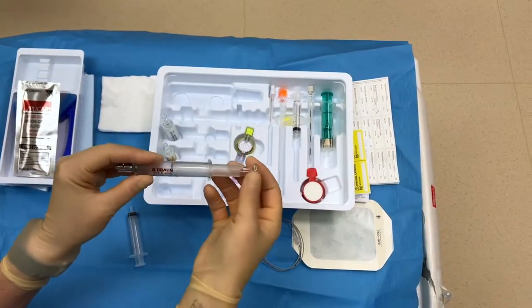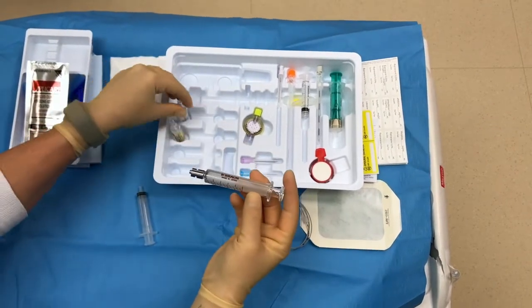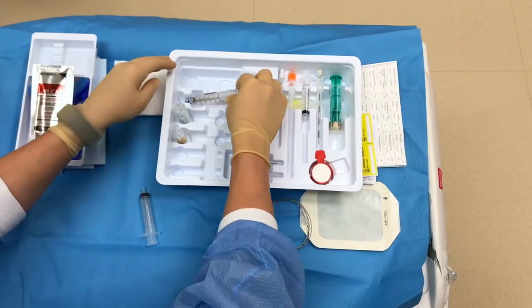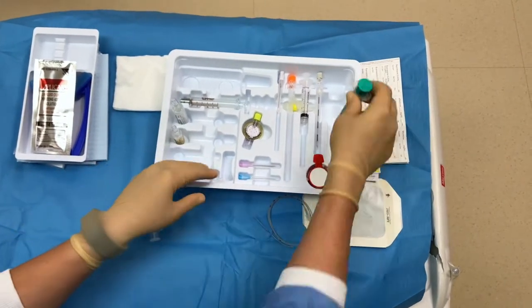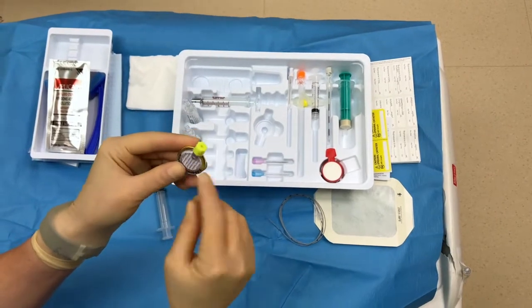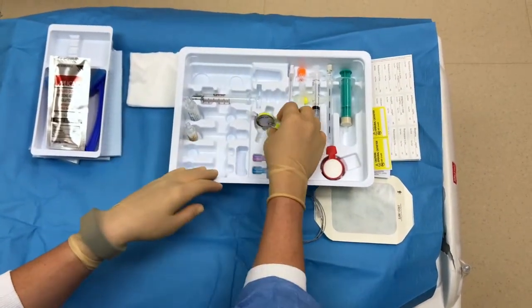Here's your glass plunger, or glass syringe. Typically, most often used with the saline solution for the loss of resistance, if you prefer saline. And here is a plastic plunger, most commonly used for loss of resistance with air. Here is your epidural filter. You'll attach this onto the catheter. It helps filter out any impurities or bubbles.